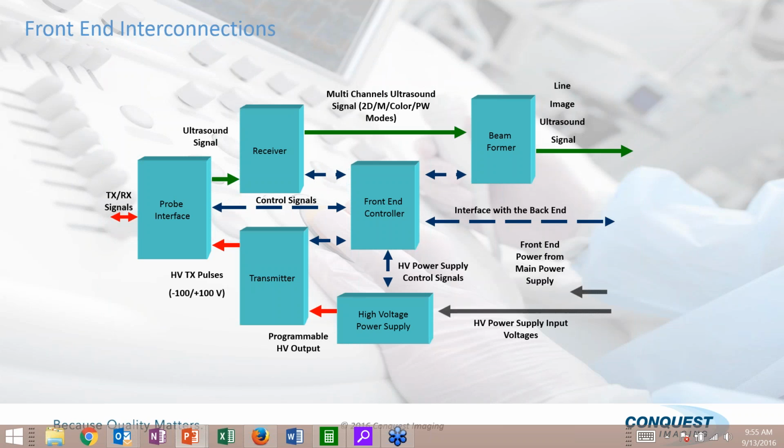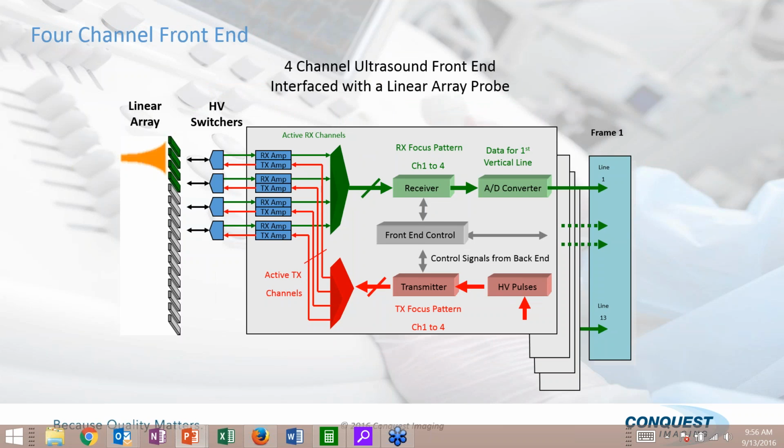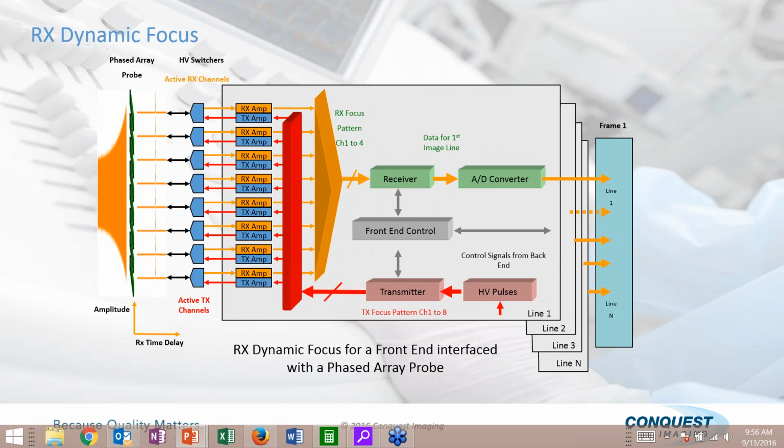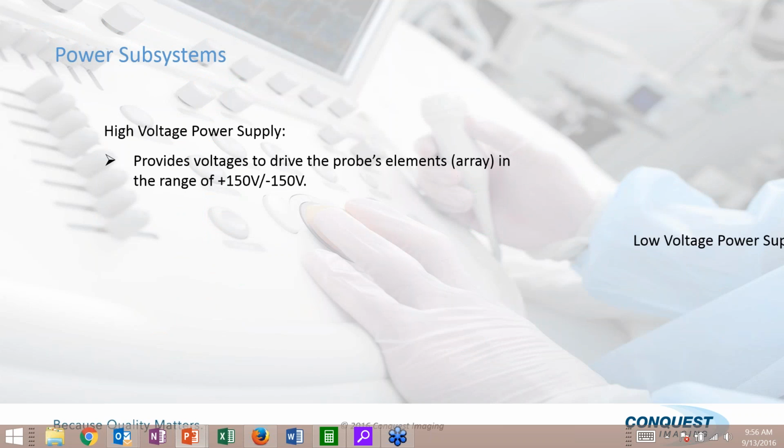So I'm going to skip through this. And again, you will all be getting this slide deck when we're done. And I want to show you the block diagram for a couple of contemporary ultrasound systems. Bear with me for just a moment.